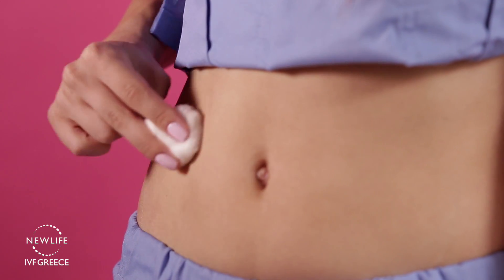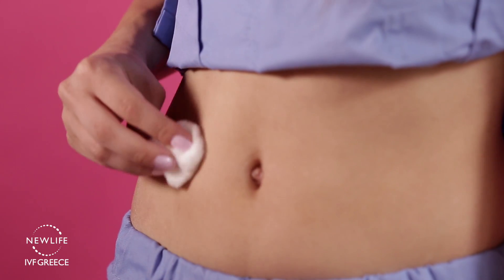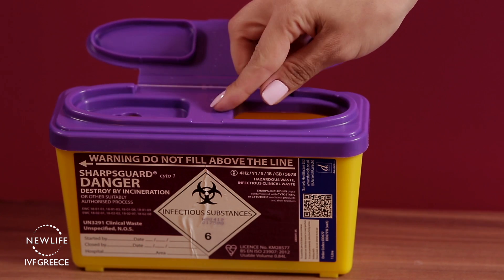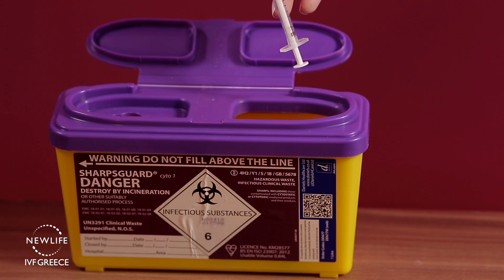Next, let go of your skin, pull the needle out gently, press down the area for a couple of seconds, and cleanse the area. Dispose of the needles, syringes, and the empty vial in a suitable container, or bring them to your nearest medical facility where we will be able to dispose of them for you.